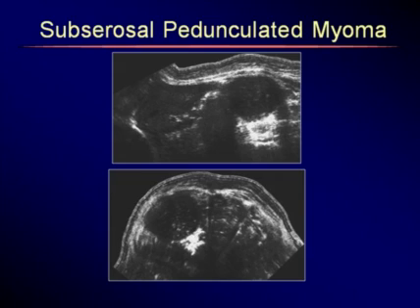It was a solid mass that kept moving around. And one day she developed severe pain. They opened her up. It was a torsed pedunculated myoma on a very long stalk. So one day it just twisted somehow on its pedicle and necrosed. So this was kind of a wandering myoma, kind of similar to a wandering spleen, if you've ever heard of those.